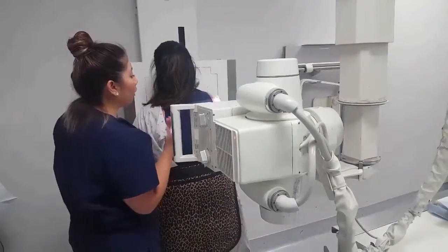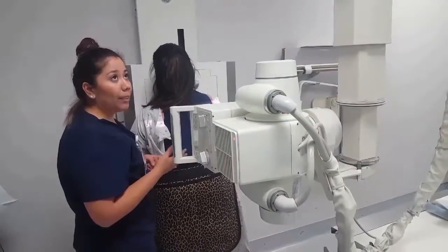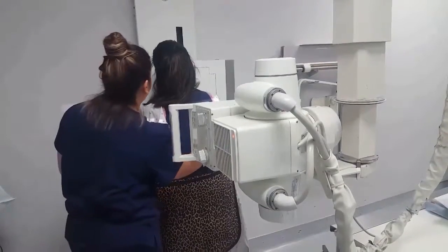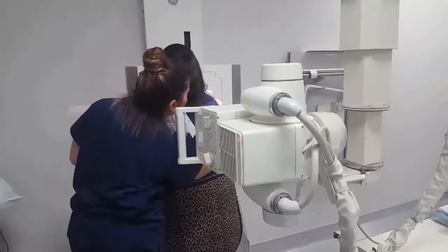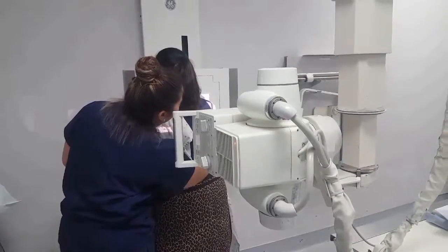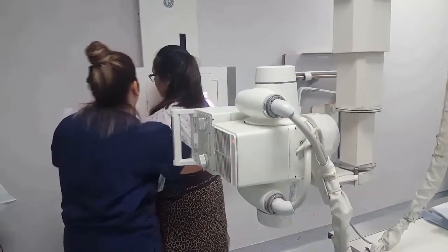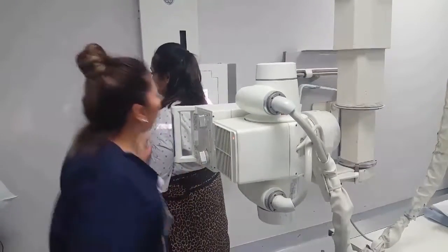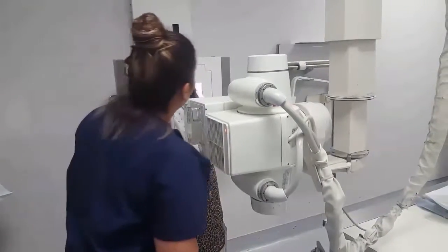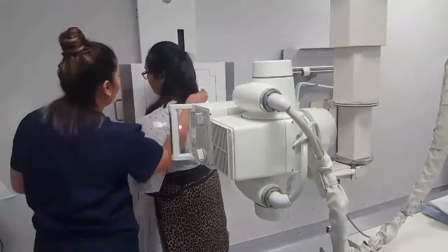But first of all, before we do that, we want to make sure that we rotate our patient approximately 45 to 60 degrees. So if I could go ahead and rotate you, making sure that our scapula is perpendicular to the IR. A little bit more. So once we have that there, I'm going to place my marker.